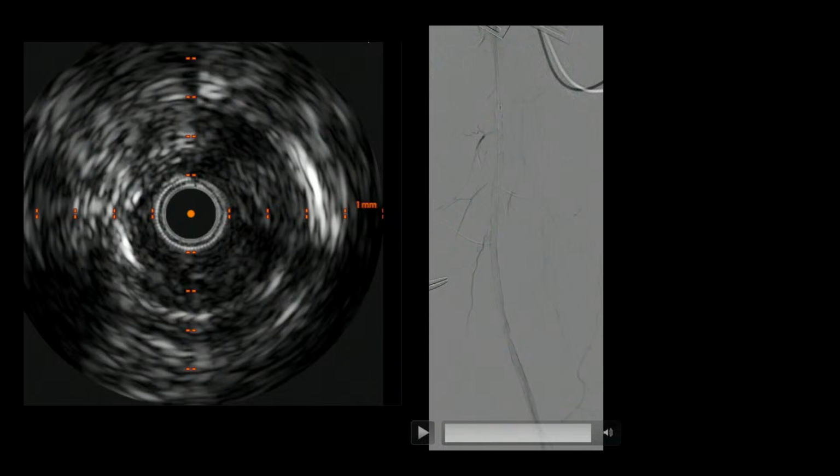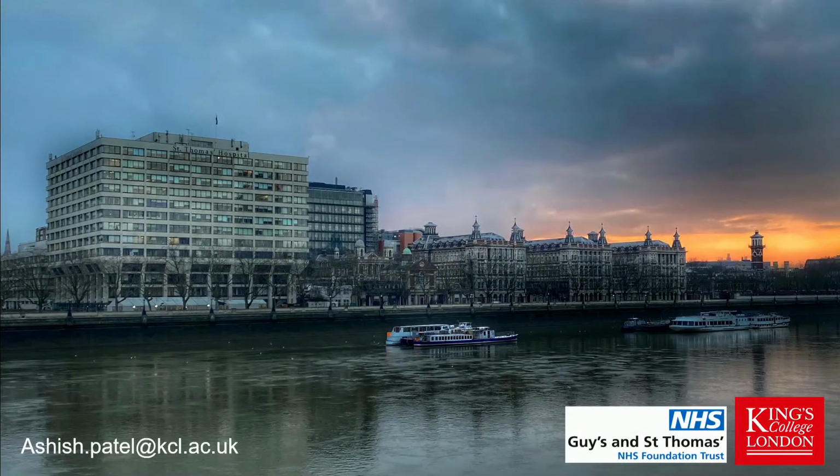But what we've noticed is that, and NT alluded to it earlier on in his first talk, when you see that speckly flow, there's usually a problem with inflow. There isn't actually good flow through that vessel. It might look good on the angiogram, but even on the angio you could see with the eye of faith that there was a delay in emptying, and that usually suggests a problem with the inflow.